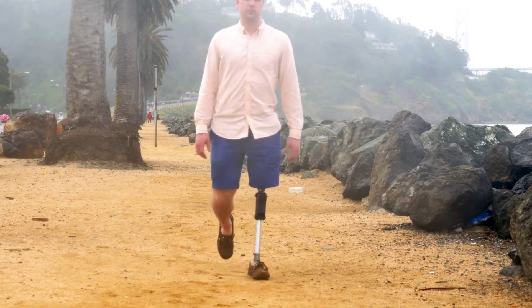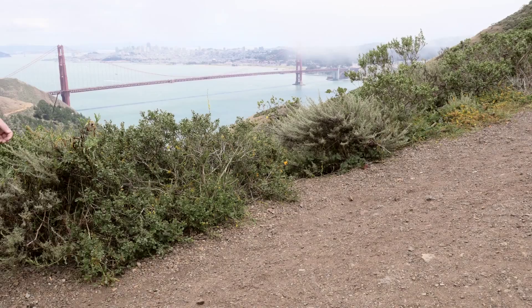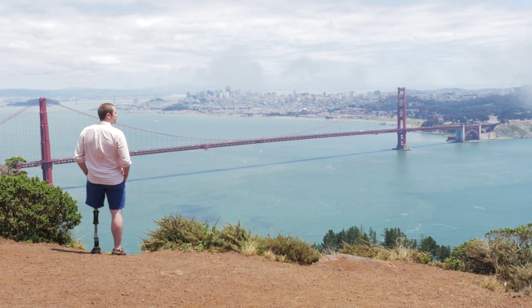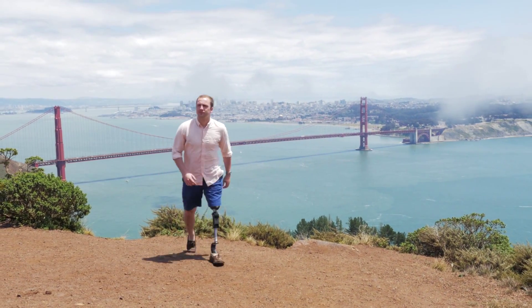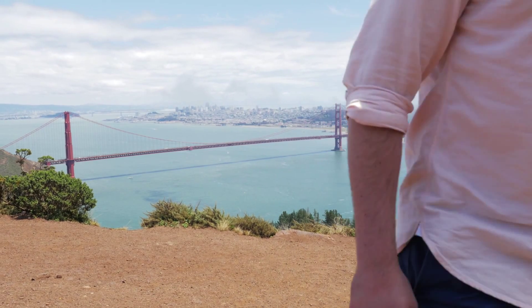With a novel swing phase controller, the AT-Knee is the non-fluid based knee joint that provides smooth, quiet, and energy-efficient gait at more than one walking speed, allowing amputees to transition from the early mobility stage to faster walking speeds.